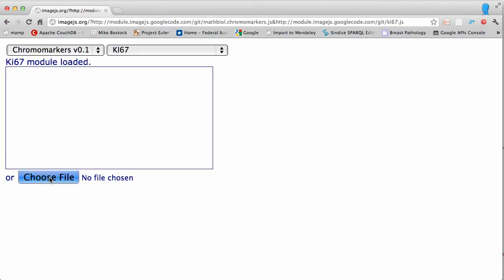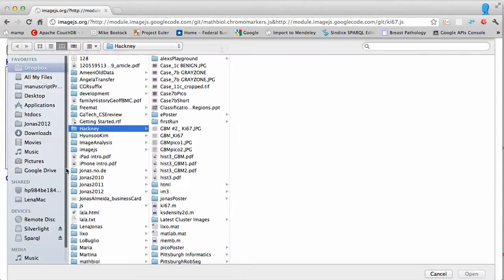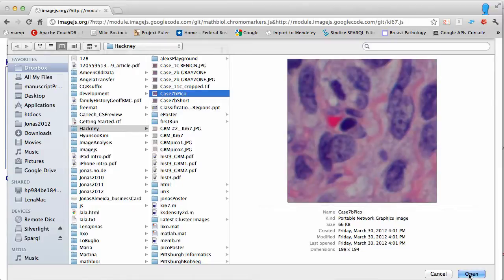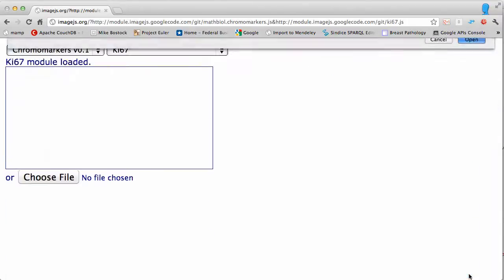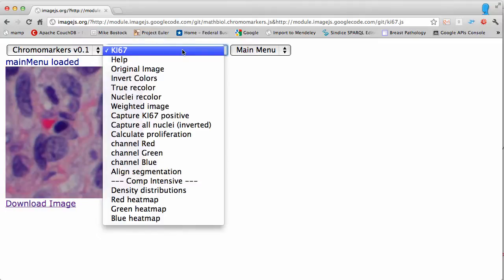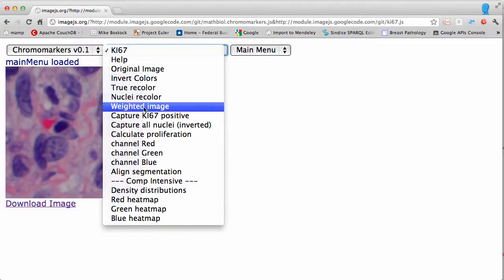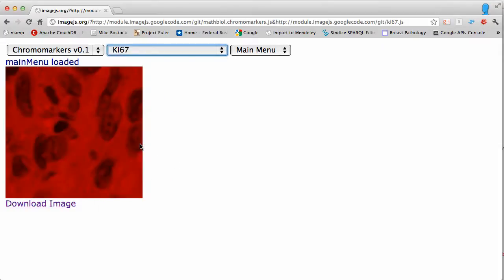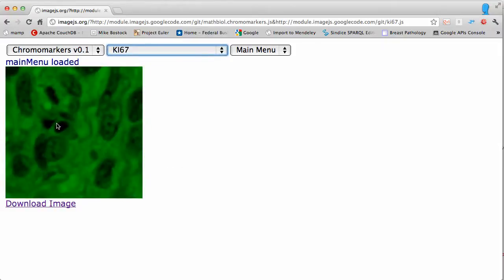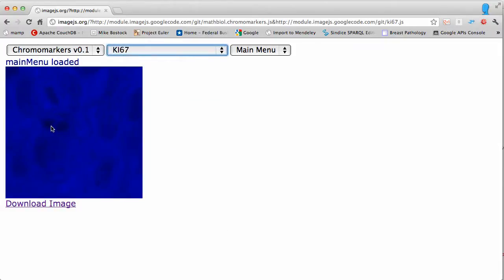Unlike confocal microscopy images where each channel corresponds to a specific measurement, in transmission microscopy images a region may appear clearly red, but when you look for the red channel you find that red is actually represented all over. It just shines through a particular region because the other channels — green and blue — are absent there.